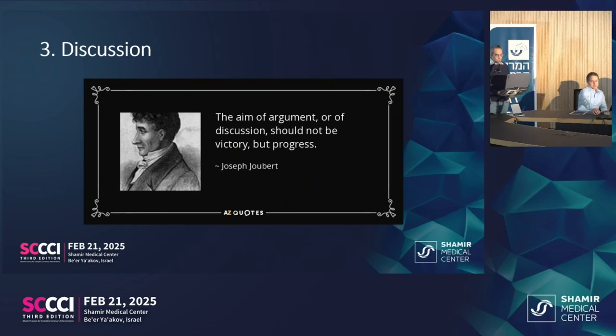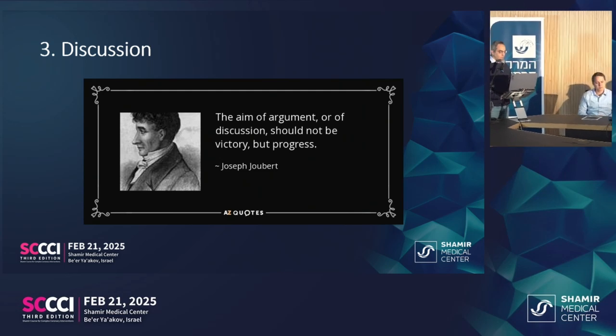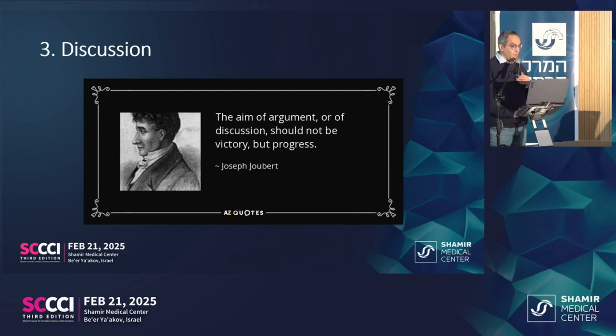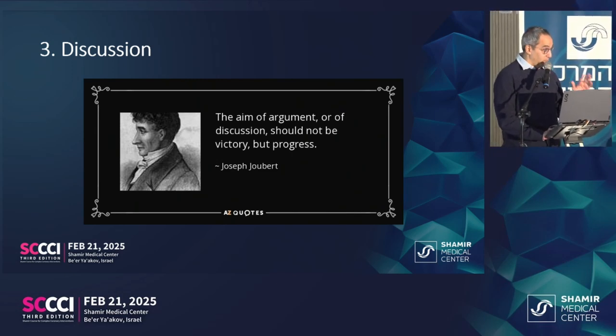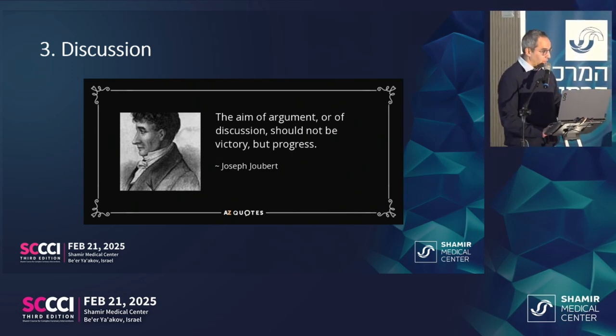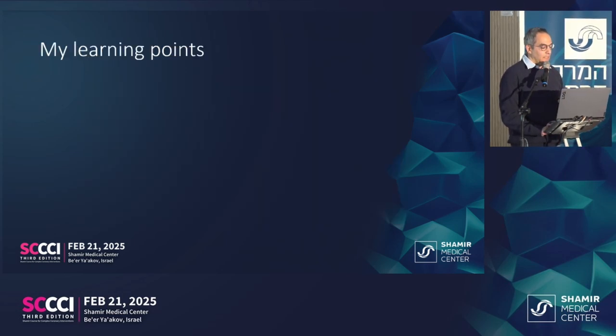Yeah. So I have two. Thank you, Leo. I think the mechanism of dislodgement was oversizing. That's because I did aim high, but I aimed high on purpose because of the mechanical MVR. There are catastrophic complications with MVR. But here is my last slide, my learning points.